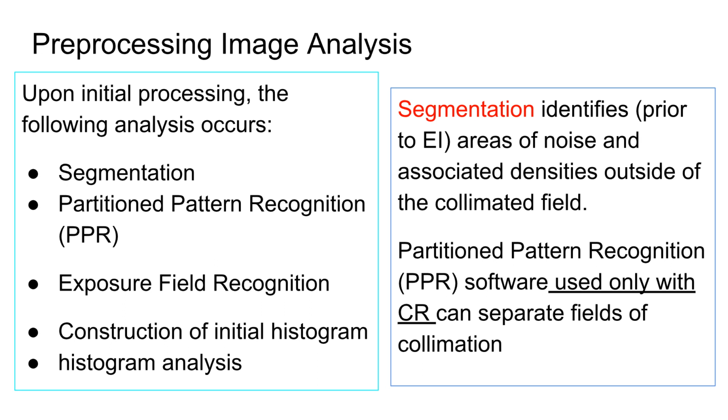Like 3 10x12s for AP, or I should say PA, oblique and lateral finger? We used to have to do that. Now the systems have algorithms where you tell it, I'm going to have 3 rectangles, each a field of collimation, but things still get messed up if the computer cannot see the borders correctly or even assess them.